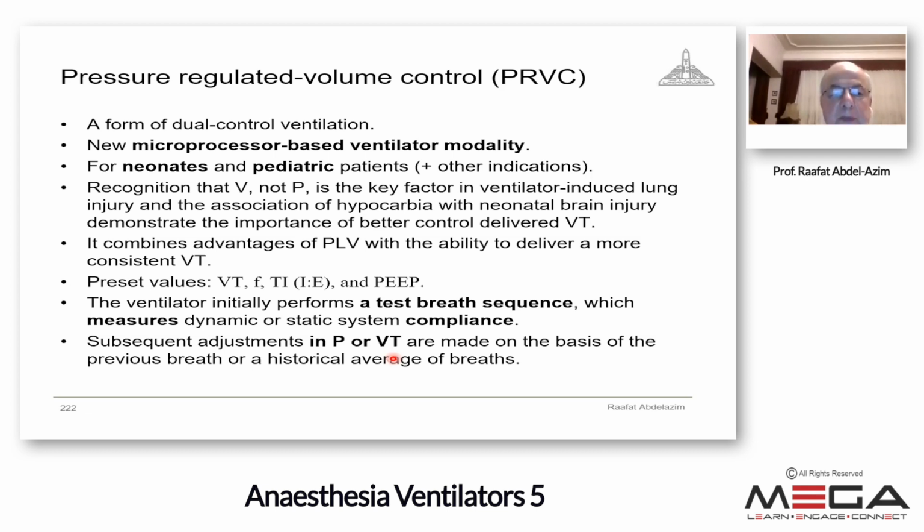The microprocessor of the ventilator will do the function. We started to use this form of ventilation in neonates and pediatrics because the changes in volume or pressure are more important in this group of population.